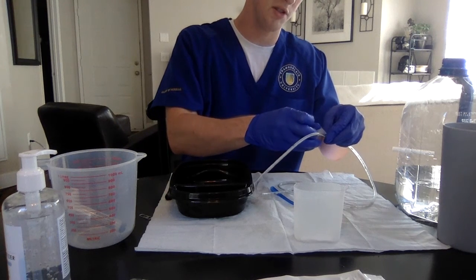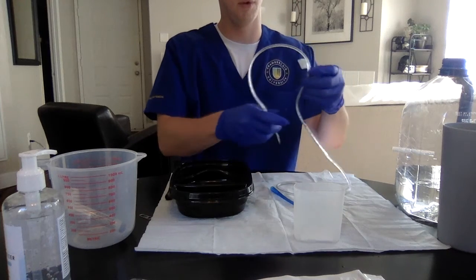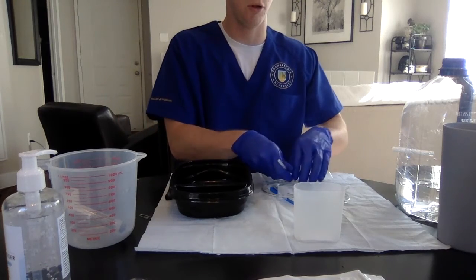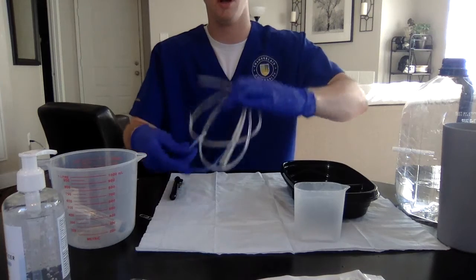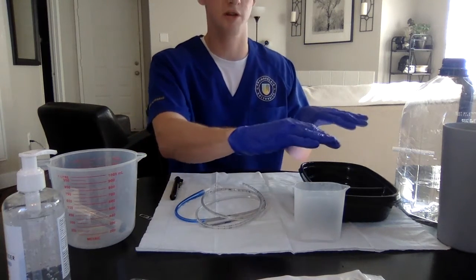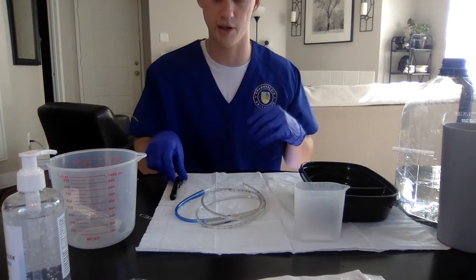So we're going to place our piece of tape marker here. This wants to turn all weird. Alright, so now we're going to move this over here. We're going to place our emesis basin in front of our patient here. We're also going to place a drape over their chest here, just in case there is any leakage.